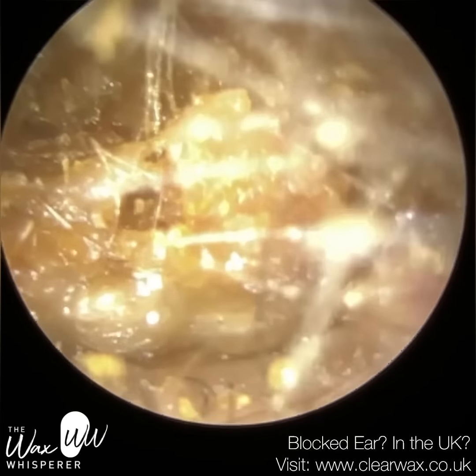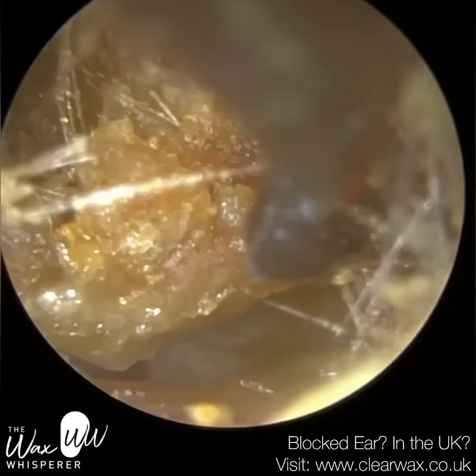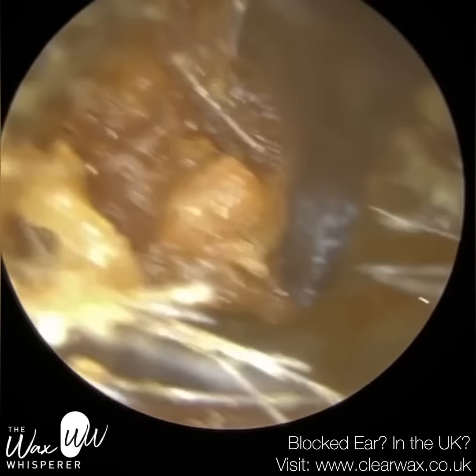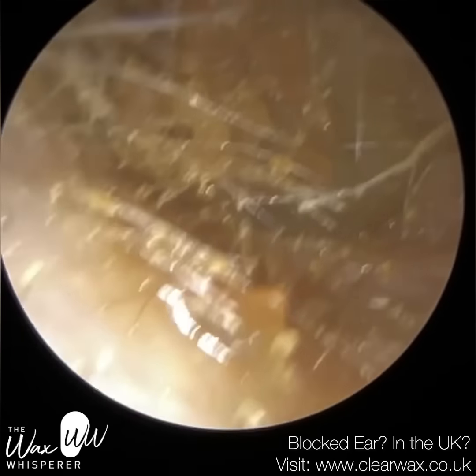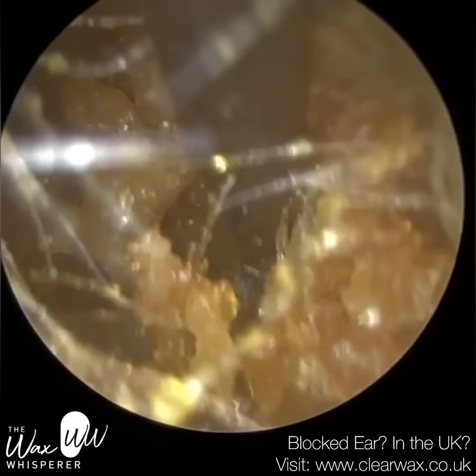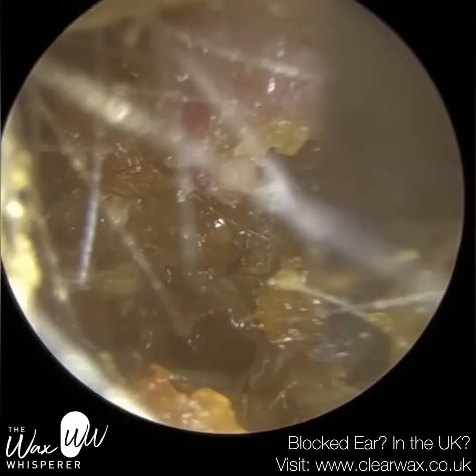And in addition, with a canal cholesteatoma, depending on the stage of the canal cholesteatoma, you're very likely to get ulceration of the skin. Here, there wasn't any ulceration of the skin. The skin was intact, and you'll see that. So this patient had this huge crater, and lining the crater was dead skin. In the case of canal cholesteatoma, normally you'd expect an ulceration of the skin and the underlying bone exposed. Now, that can also happen with a benign osteonecrosis, but in this case, it wasn't so. So you can see some more granulation tissue there.